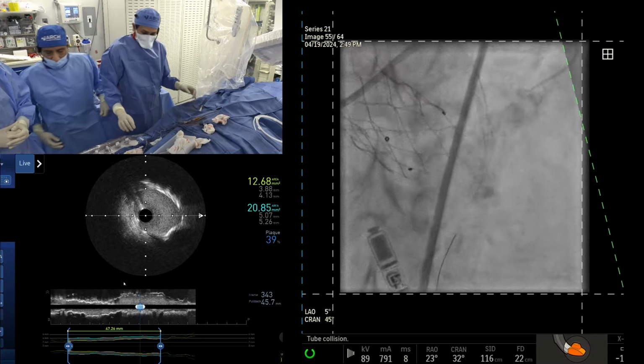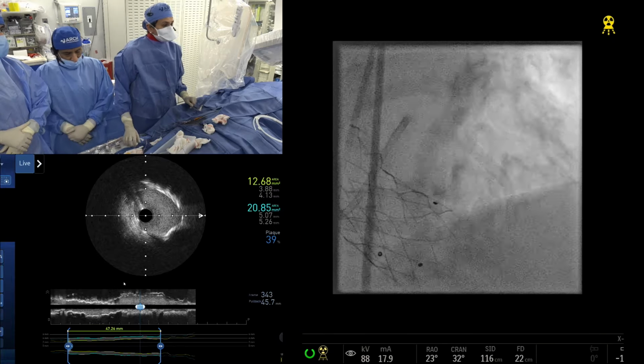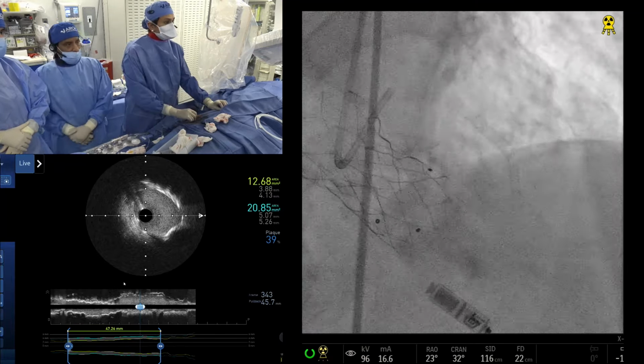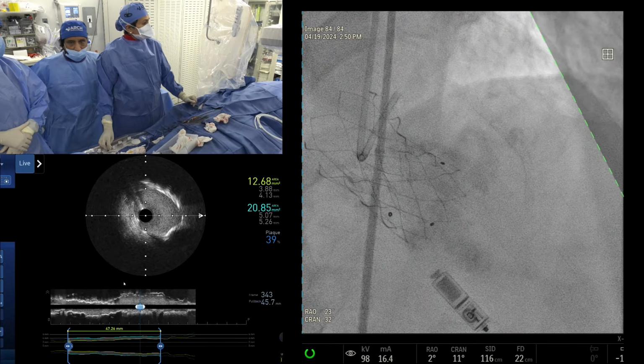And within less than a month, we'll be doing a drug-coated balloon before coming out in this case, which agent will be available by end of this month clinically, and although very expensive, will be available for our clinical use.